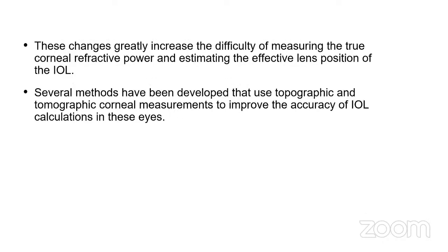These changes greatly increase the difficulty of measuring the true corneal refractive power and estimating the effective lens position of the IOL. Several methods have been developed that use topographic and tomographic corneal measurement to improve the accuracy of IOL calculation in these eyes.